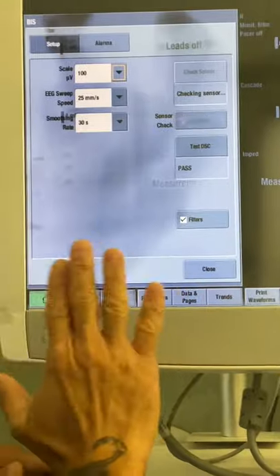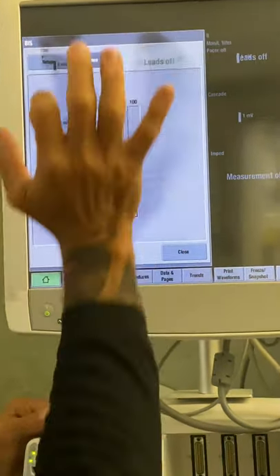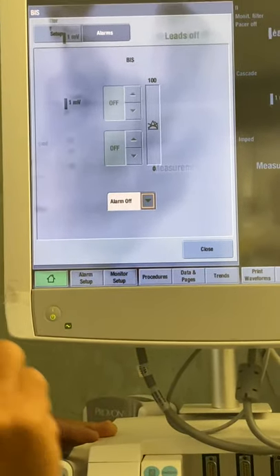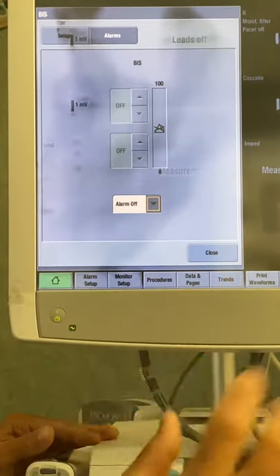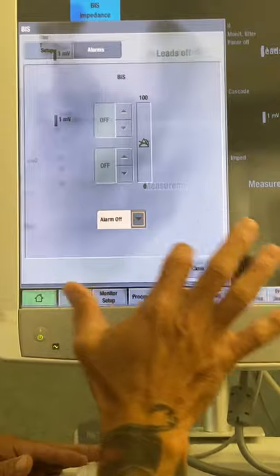Now, these parameters are already set. You do not have to change them, and you do not want to turn on your alarms. This is not something that you need to be warned of. This is something you're going to check periodically. So don't set your alarms. You're just going to have more beeping for no reason.